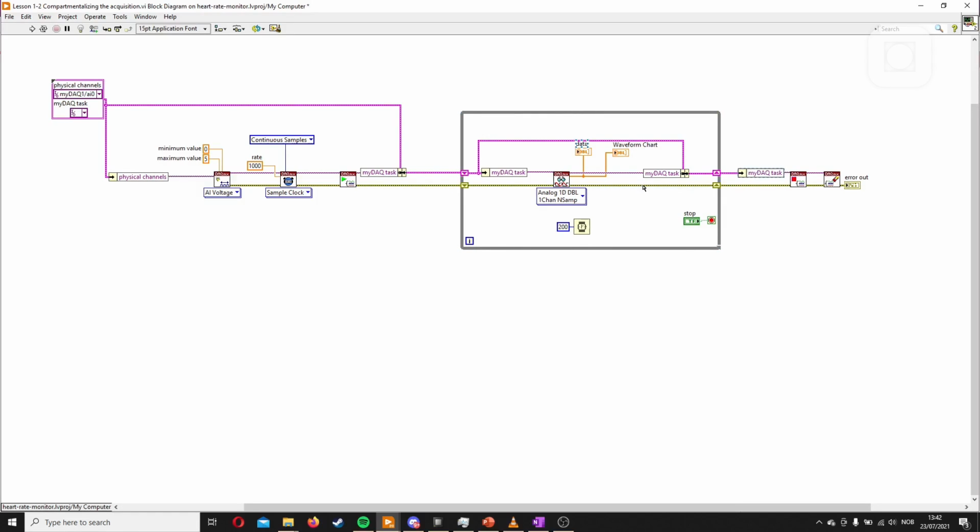And before we start compartmentalizing, I want to change this to a waveform. So I'll just delete the data array, and I'll add it here, multiple sample waveform samples. This is because then we get the timing data too. I could have done this from the beginning, it doesn't really matter, but now I want it.